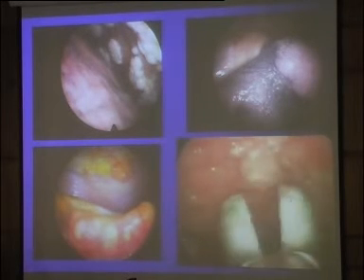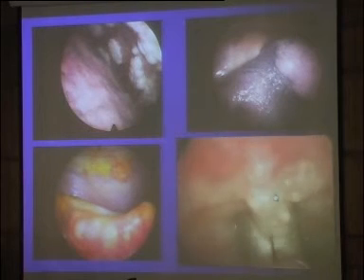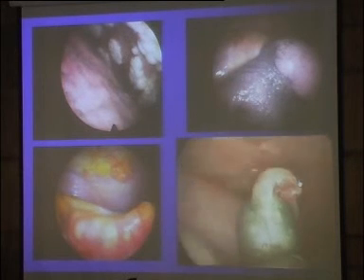It's a deep biopsy. You can see what's happened, and you have a huge specimen for sure. In this case, it was easy to take because there are plenty of nodules, but it makes the procedure easier.